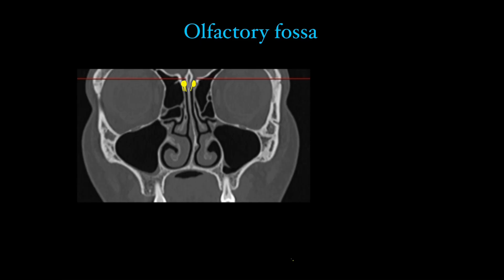The olfactory fossa contains the olfactory bulb and rootlets — that is the major and only content.